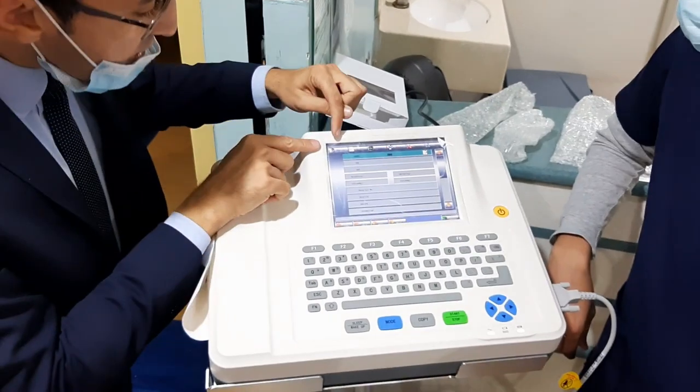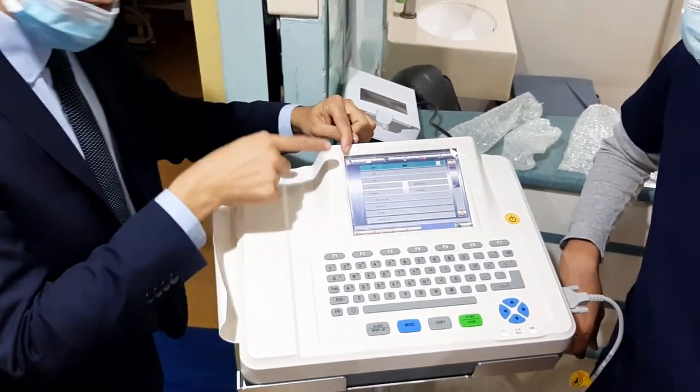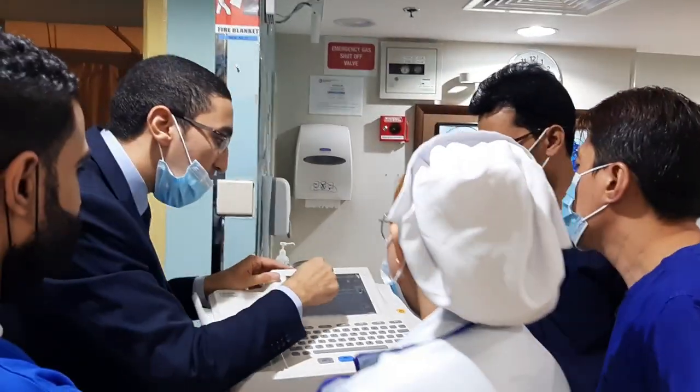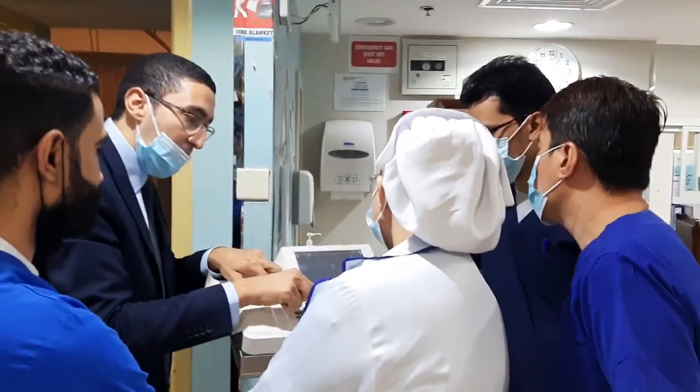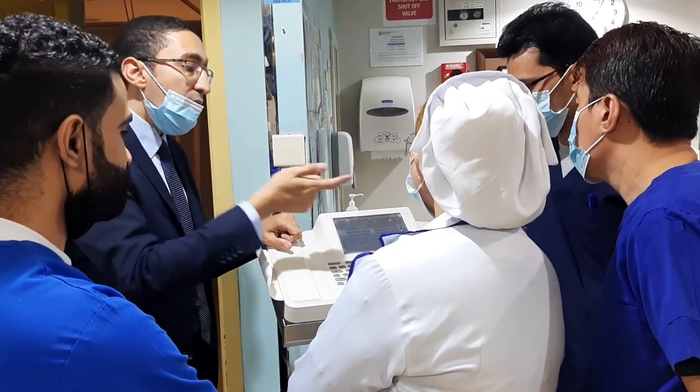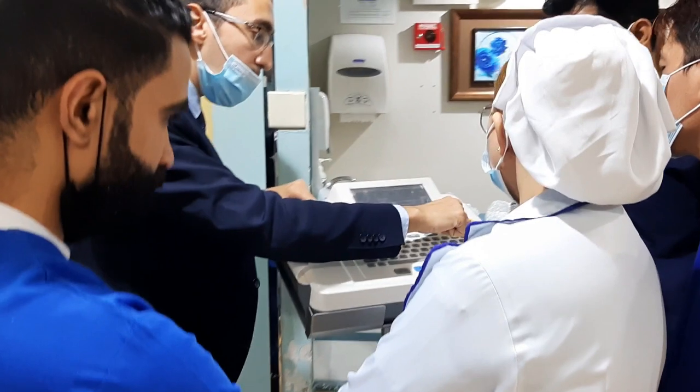Okay? First menu, register. Register this one to enter the data observation. Very, very easy to enter the data observation. A name, okay? So you will enter same like keyboard, same like computer, any name you want, okay? How to cancel? You will cancel by here, like slash, this one.